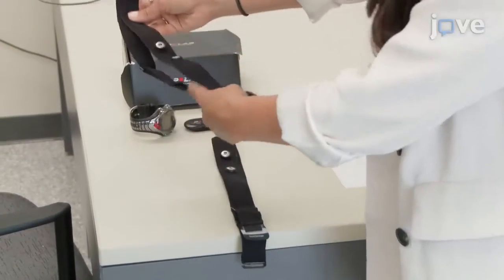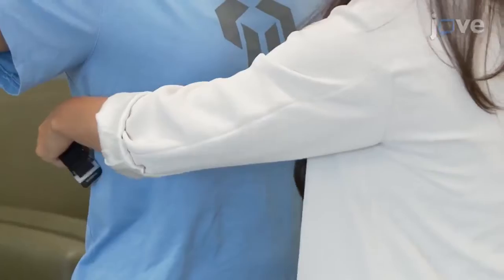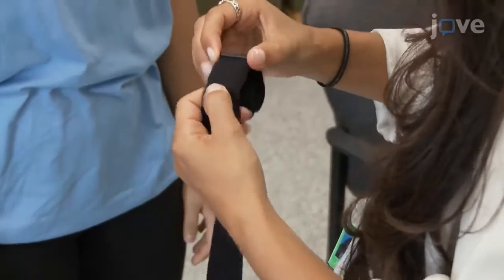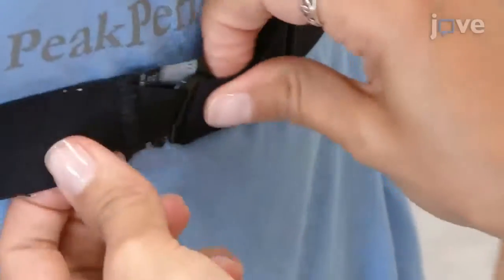Next, select an appropriate chest strap size according to the circumference of the participant's torso, and place the strap around the torso over the participant's clothing. Adjust the strap to reflect a tight yet comfortable fit, and confirm that the strap is securely fitted around the sternum on the xiphoid process.